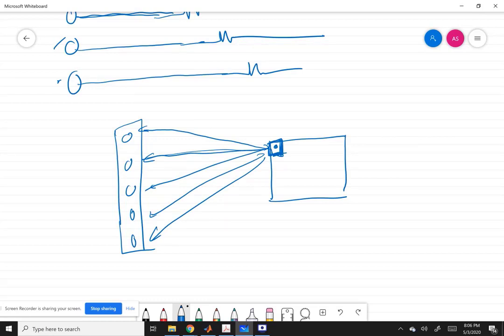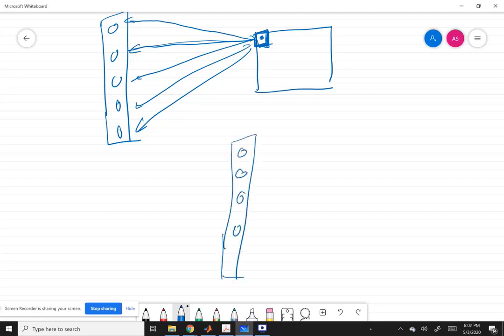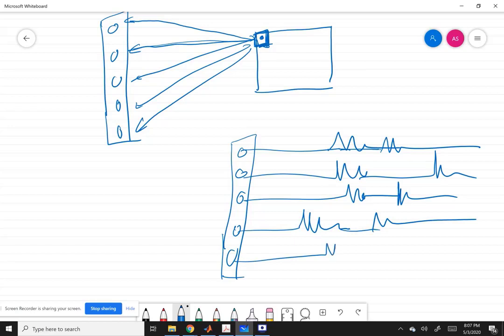Once we fire, we have a series of radio frequency waves for each transducer. We don't know what kind of objects created these radio frequency waves. Suppose you are trying to reconstruct this pixel, and the total time of flight which you calculated is t1 for the first transducer, t2 for the second transducer, t3 for the third transducer, t4 for the fourth transducer, and t5 for the fifth transducer.